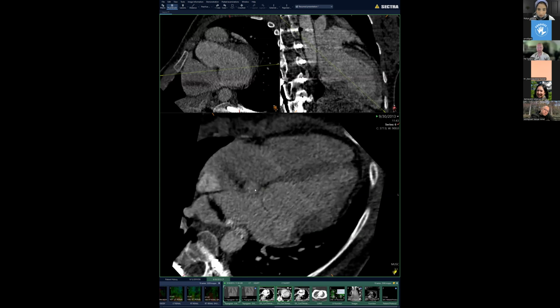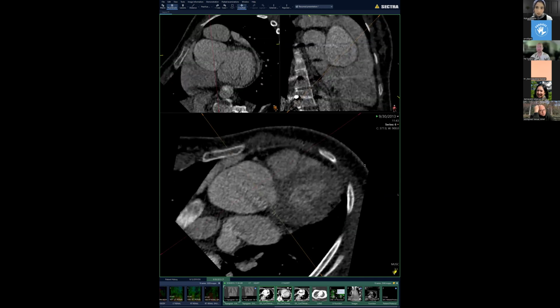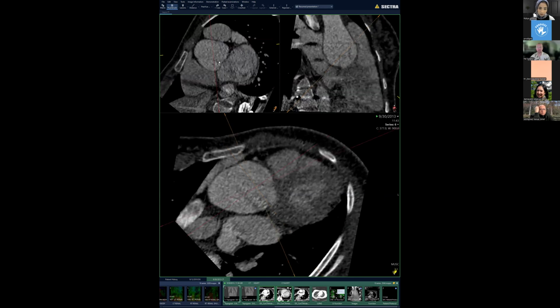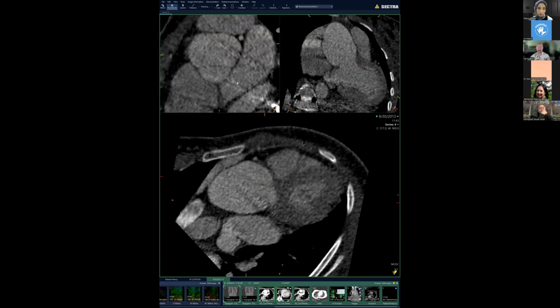Also, while we're at it, just discuss the measurement of the aortic root. The correct measurement of the aortic root is going to depend on the abnormality that you see. In patients where the aortic root has a radial symmetry, like in this case, you will measure sinus to commissure. Where two leaflets meet, that's called a commissure. And obviously, the three sinuses of Valsalva, if they're present, that's how you will measure. And you will measure it 3 times and take the average of these 3 measurements. So sinus to commissure. Some people advocate for maximal diameter sinus to sinus, but it's really just be consistent when you're following up cases. That's the most important thing.